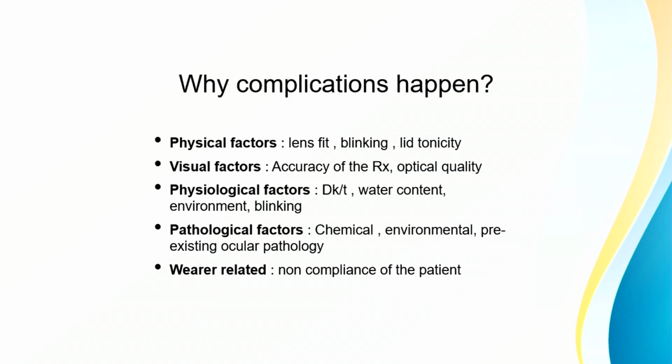And optical quality: if the lens optical quality is not good, or the eye is dry, or the lens wettability is poor, you end up having a complication. Physiological factors like DK/t. What is DK/t?